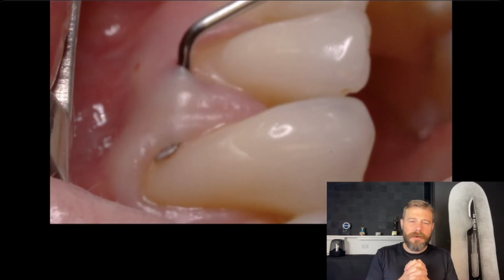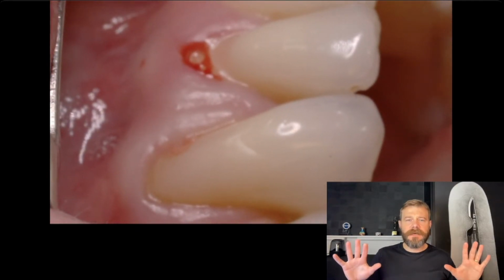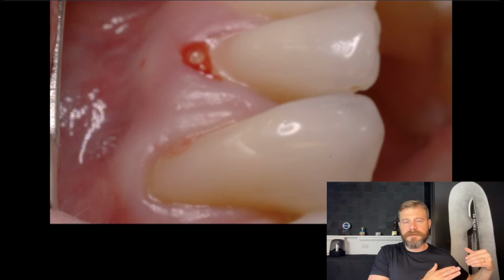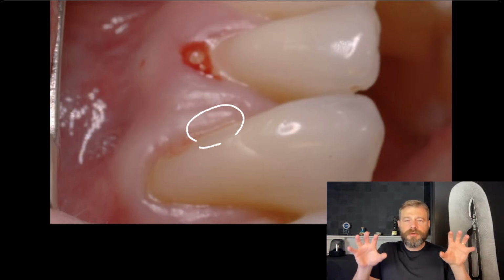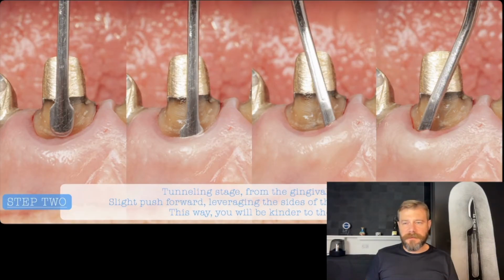Because with tunneling, one of the great restrictions is how much the tunneling flap can move in the coronal direction. And usually the problem is not at the releasing in the apical margin. The problem is exactly the detachment of the papillas itself. If you do not detach the papillas properly, the tissue in the center can move, but the papillas are going to hold this movement of the flap. So to have an instrument to execute this properly is something that we need to have.